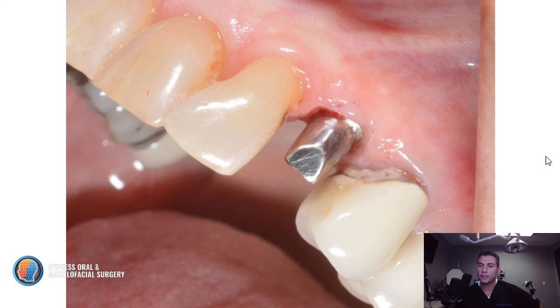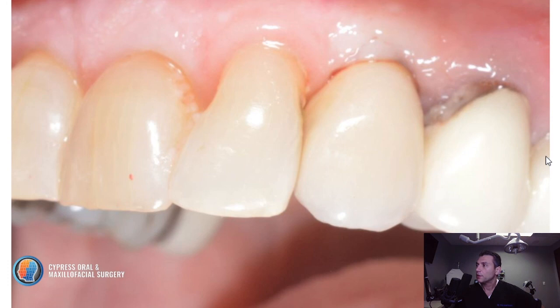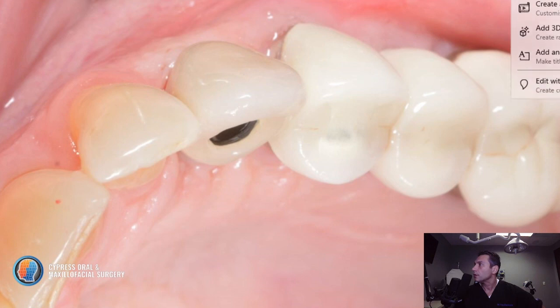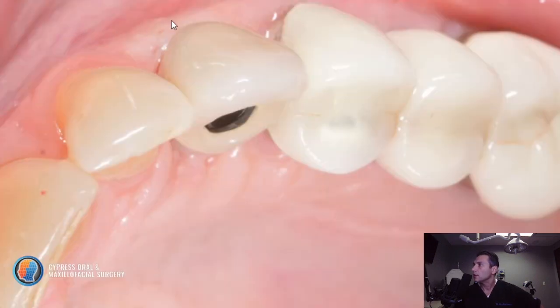And again, this is the custom abutment in the mouth. It screws into this implant, and the crown is cemented right on top. I just placed this for pictures. This patient went to her general dentist to do the final restoration. Again, another view. One thing you can appreciate here is that there are no black triangles, and the soft tissue contour is perfect, what we expected out of this restoration. There are no black triangles in this area and in this area.